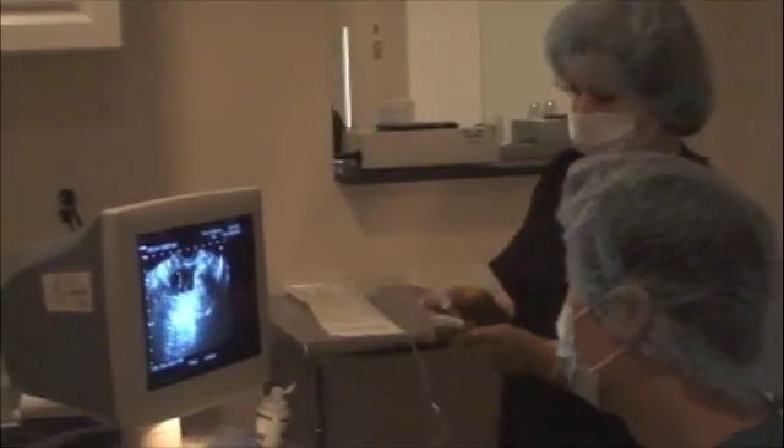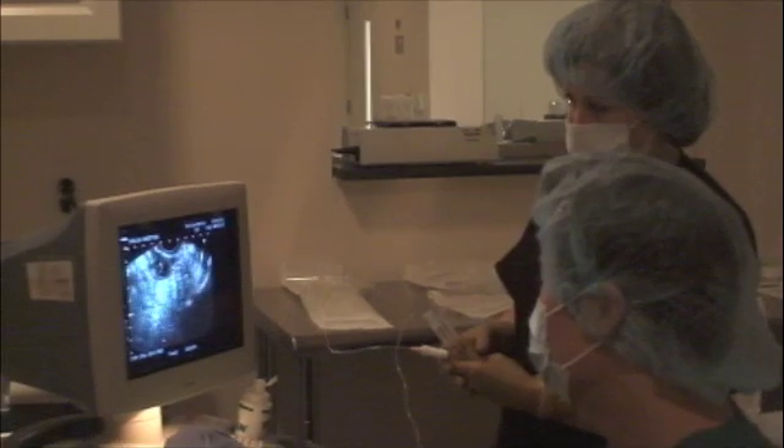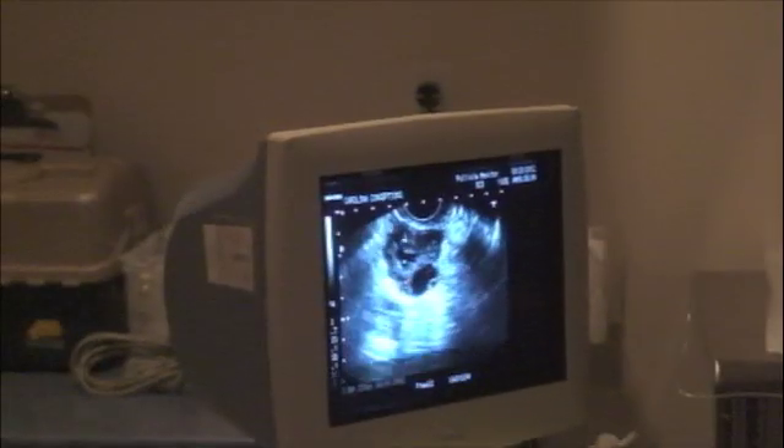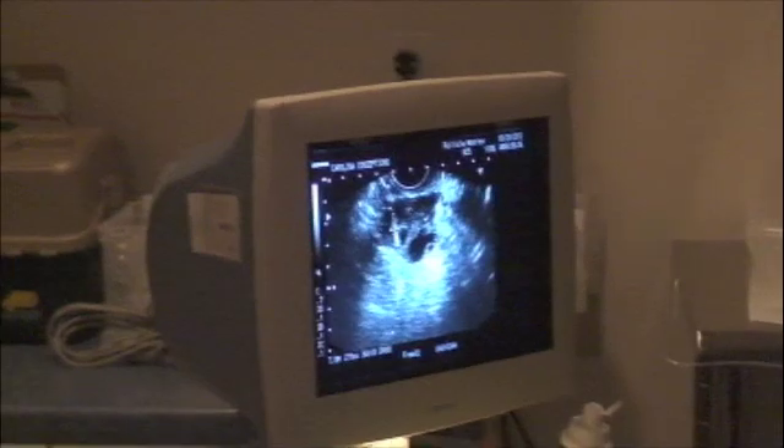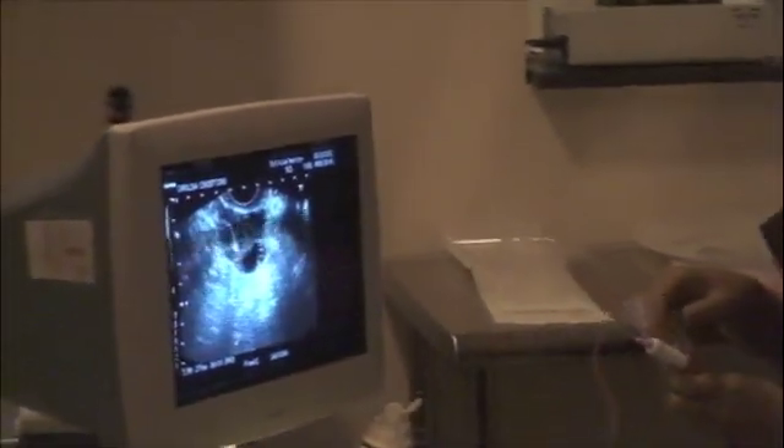I'm positioned between the patient's legs, performing a vaginal ultrasound. Attached to the ultrasound probe, there is a needle guide that allows me to safely direct the needle through the vaginal wall and into the ovary.